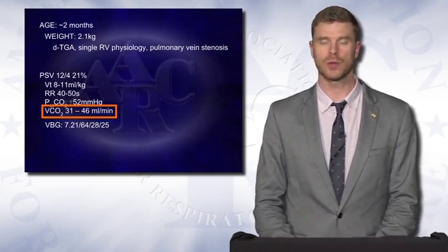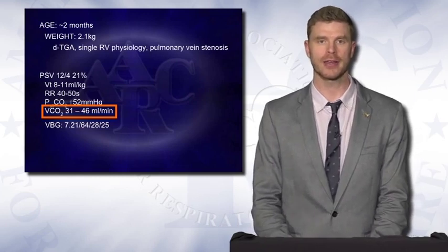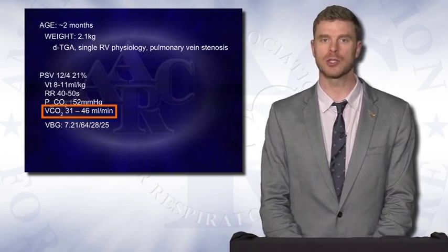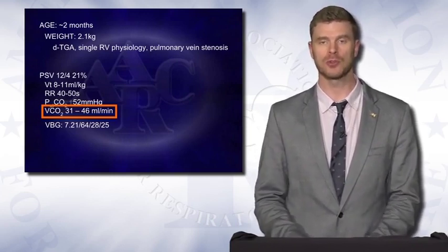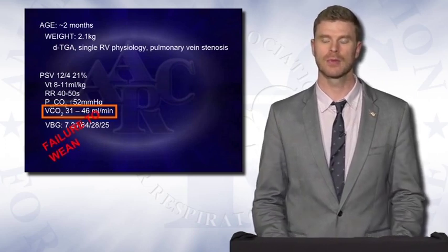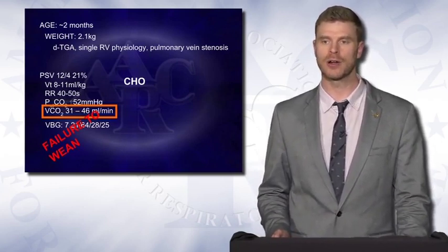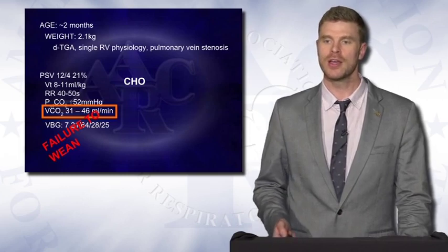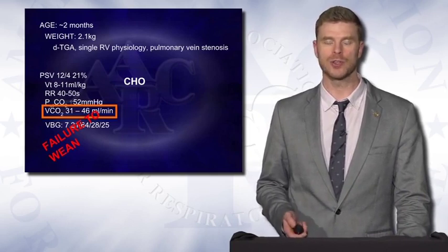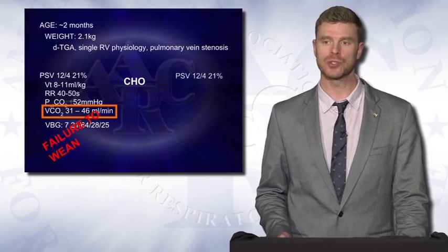This patient was presented with having a fairly stable respiratory pattern, albeit a complicated surgical cardiac case. The team wanted to extubate, wanted to get this patient out of the unit, wanted to get this patient home. However, they were unable to do so, unable to really wean below the settings that they were on. So why is that? Well, given that this is a VCO2 discussion as part of our look into CO2 monitoring, the answer is probably the VCO2, and that's exactly what it was. CHO, the carbohydrate load that this patient had been eating or really being delivered in the ICU was excessively high.